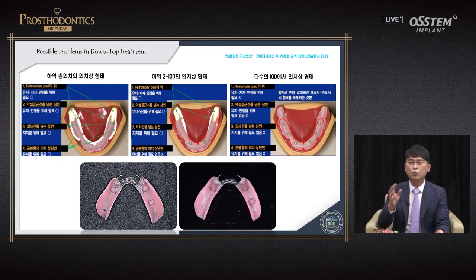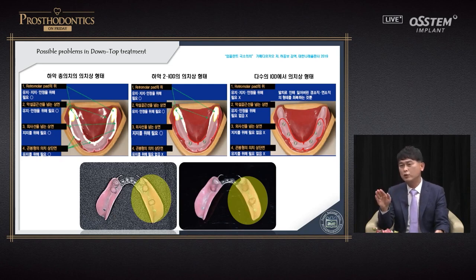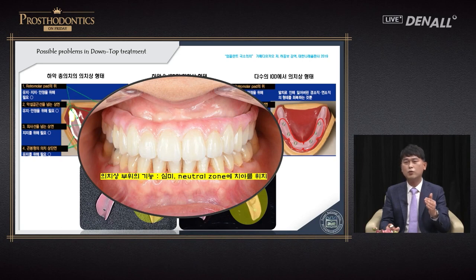With 6 implants, the denture base size can be further reduced. It is only for aesthetics and the positioning of the artificial teeth. For the RPD, as the implant is placed, the support is provided and the buccal portion is cut off. If a function is provided by an implant, the function can be removed from the prosthesis, otherwise there can be complications from the prosthesis.